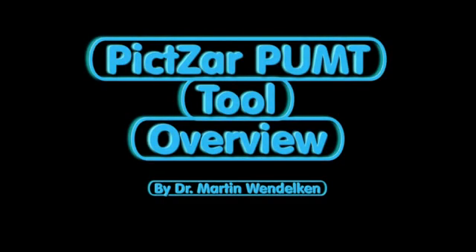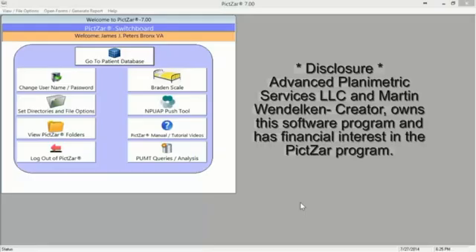This video is a presentation of the PictZar PUMT tool. We begin on what's called the switchboard. The switchboard has the buttons that take you to the different areas of the program, and we're going to go to the database program starting with the demographic area.